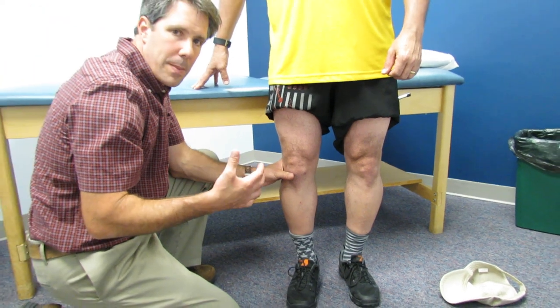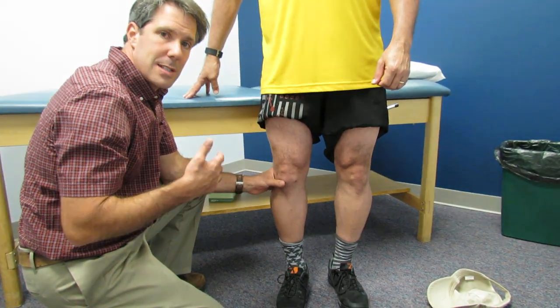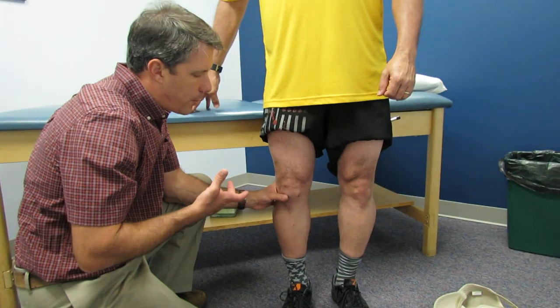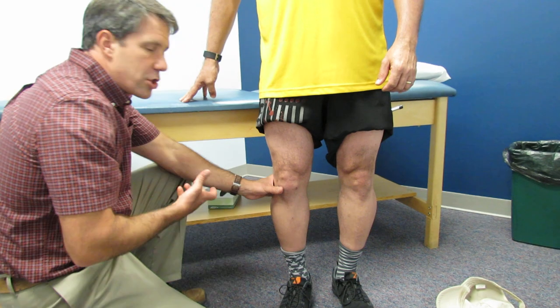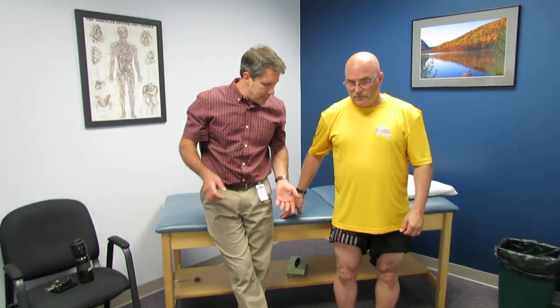He is on his feet all the time and he's active — he likes to exercise, do the elliptical, run, walk through the woods, snowshoe, and those types of things. If we can put him into a brace and open up that medial joint a little bit, he's not going to bear so much weight on it and should do much better. The brace is coming in a couple of weeks and we're going to give it a try.